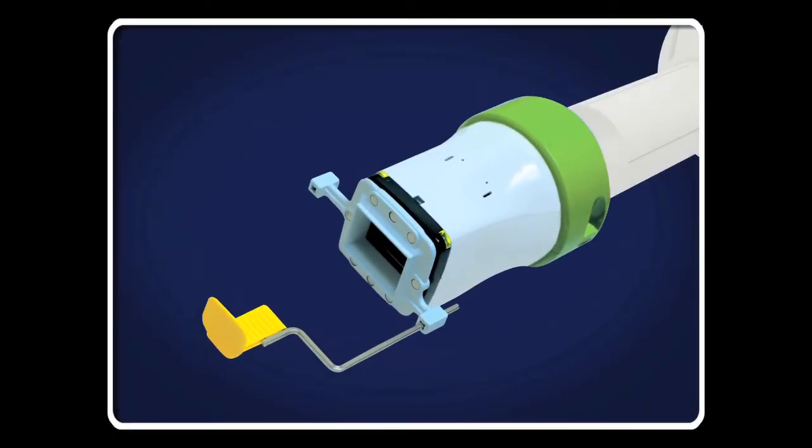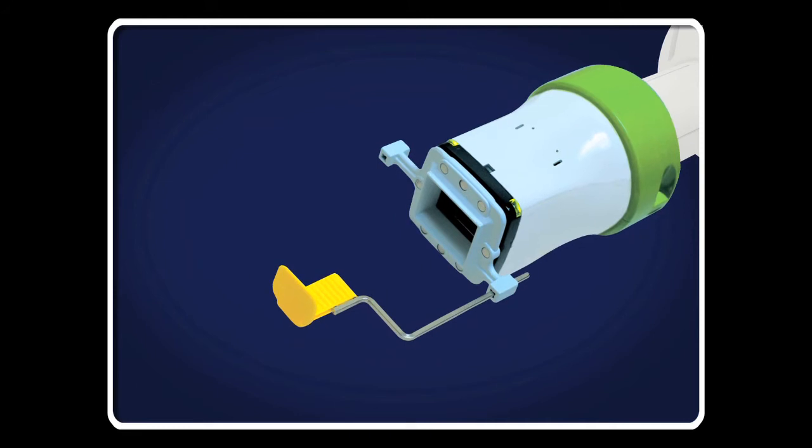TruAlign is a rectangular collimator that slides over the cone of your existing X-ray system to shape and control the size of the X-ray beam to the size of the receptor.